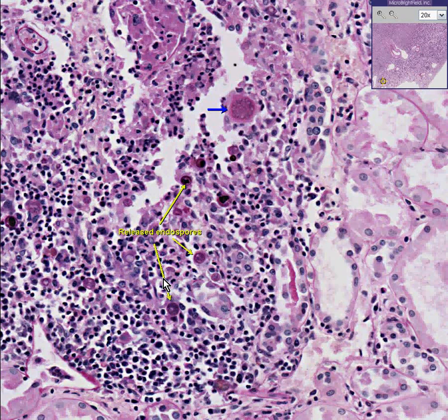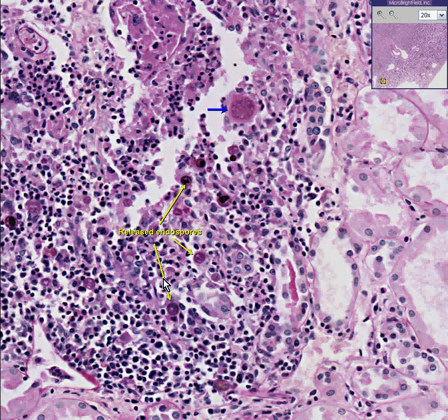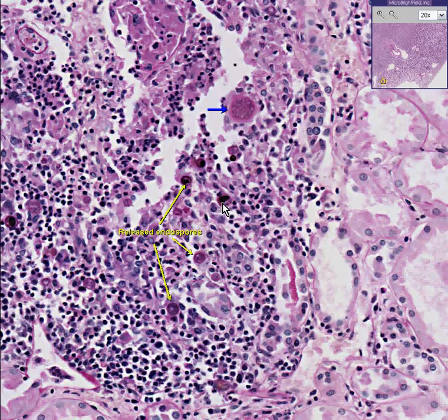Here's an area where you have both endospores within the spherule and free. This fungus is Coccidioidomycosis, which classically looks like this. Rather than think of a million different fungi, just remember: the three major systemic fungi — which infect not only the lung but many other areas of the body — are Histoplasmosis, Blastomycosis, and Coccidioidomycosis. This is the only one of the three that shows endospores released by spherules.